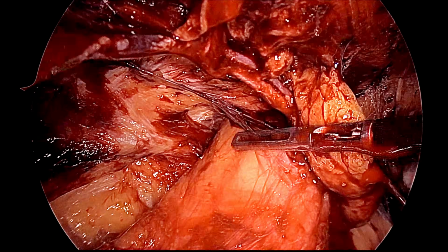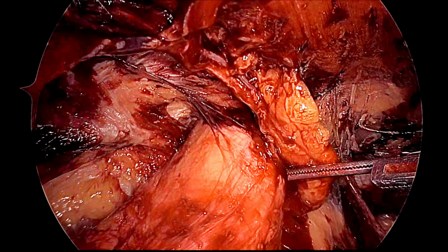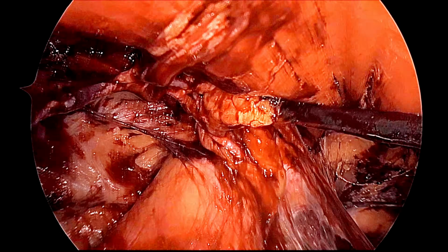So, this lateral dissection is almost over. After that we will go to the medial dissection and we will check for the Cooper ligament.